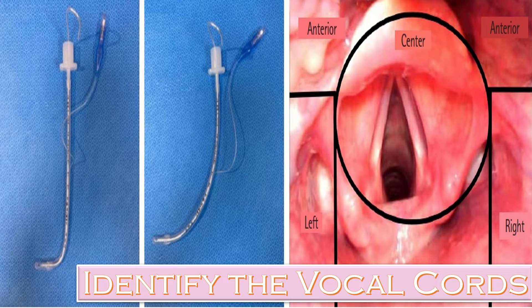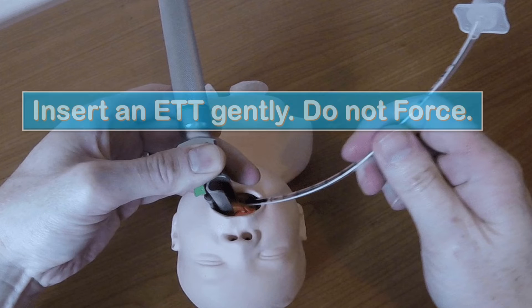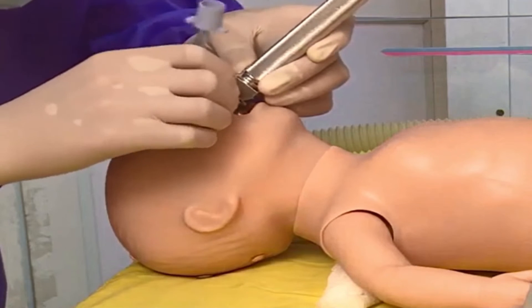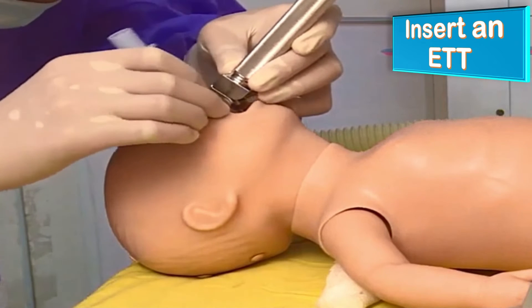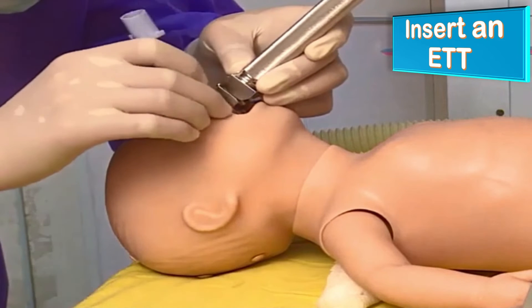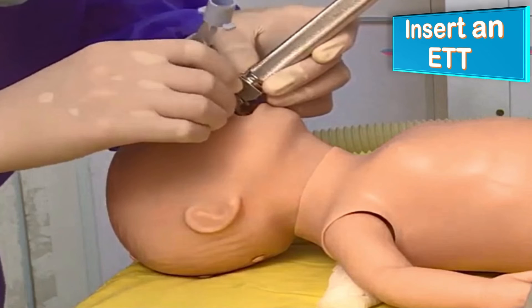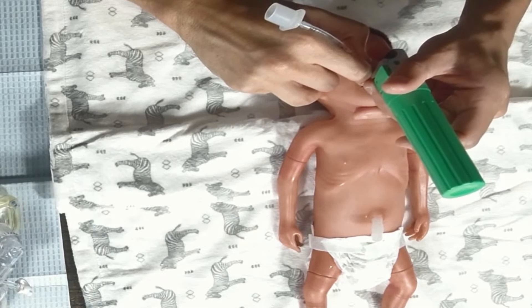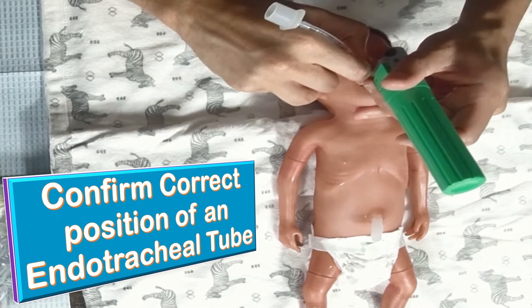With the help of the laryngoscope, identify the vocal cords carefully before inserting an endotracheal tube. Once you identify the anatomy of the epiglottis and the trachea, introduce the ETT gently — do not force it into position. The laryngoscope light will guide you in visualizing the epiglottis and the tracheal opening. Even after insertion, look again with the laryngoscope to confirm whether it is in the correct position.